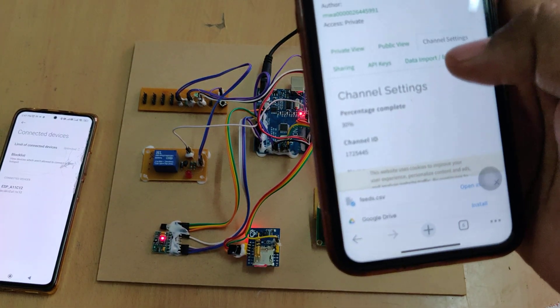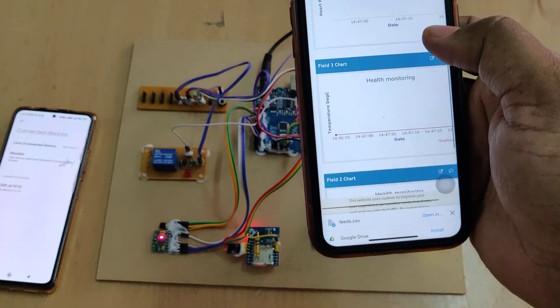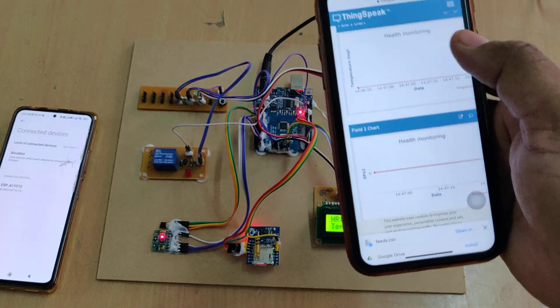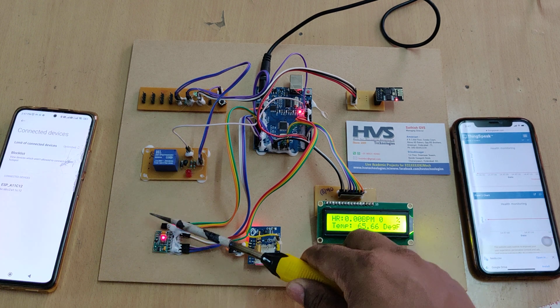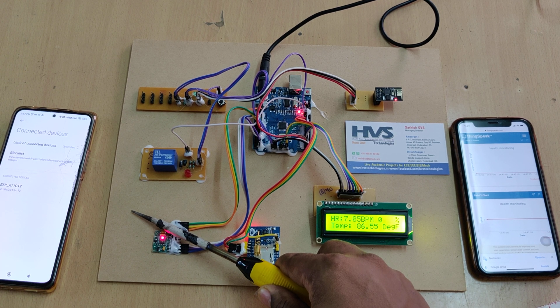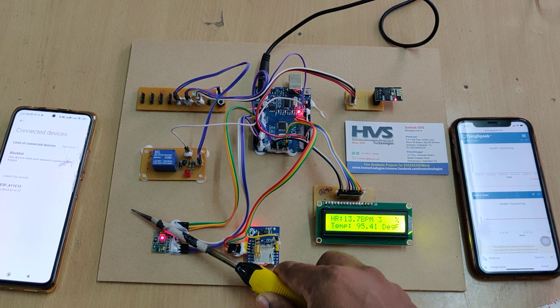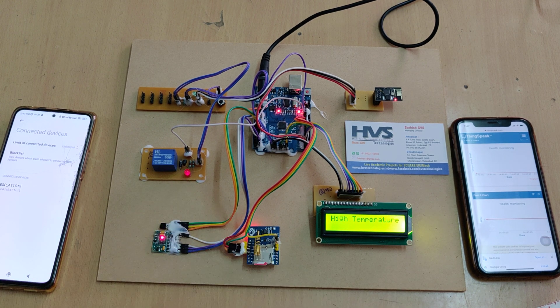To verify, go to the Private View — previously there was old data, but now it is cleared and we get fresh SpO2 and temperature readings. To demonstrate the alert feature, we heat the temperature sensor. When it goes above 100 degrees, the buzzer turns on — the relay gets switched on — and SMS alerts are sent.